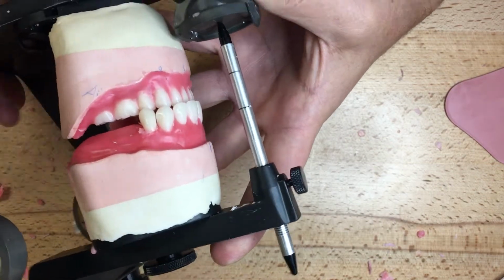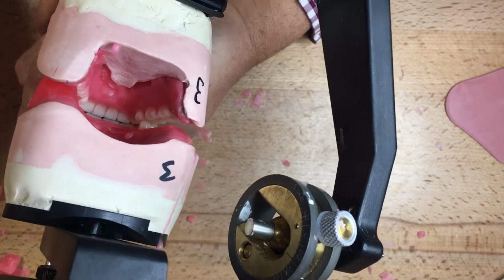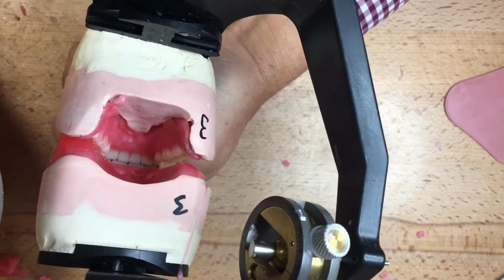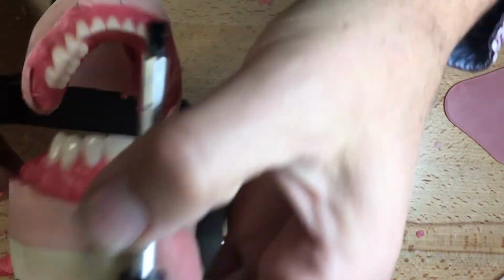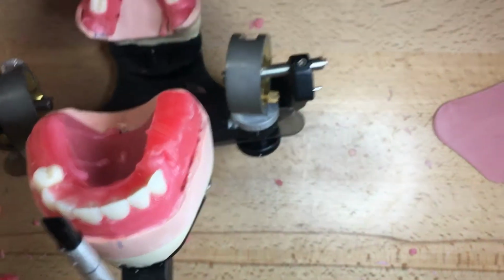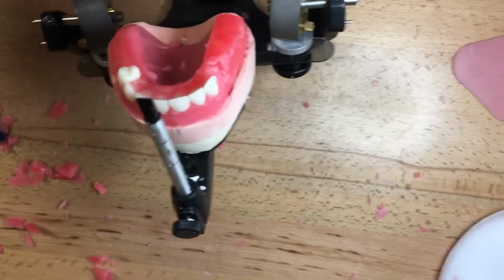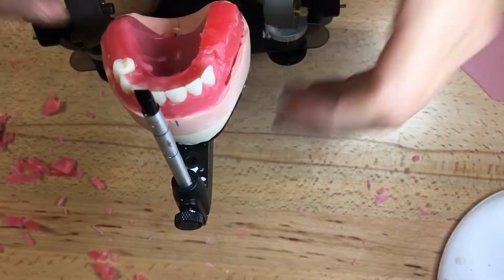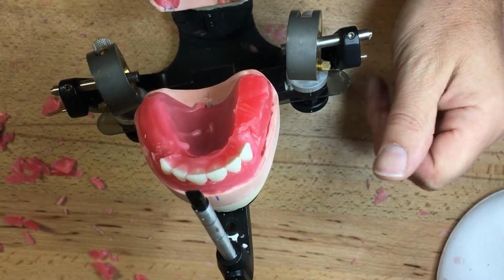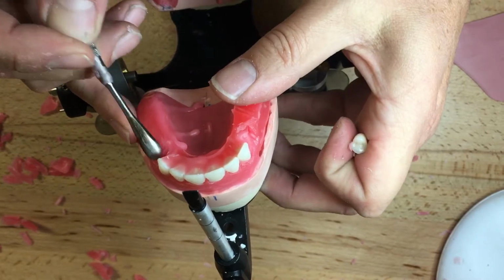So I have 5 occluding with 5. I have the upper lingual cusp hitting into the occlusal fossa of the 5. So it's a tooth-to-tooth relationship, the lingualized setup. One thing I don't have here is, let me just lift this up a little bit more, the amount of overjet that I wish to have. Overjet of the posterior. It seemed to be kind of tilting in a bit on my occlusal scheme.